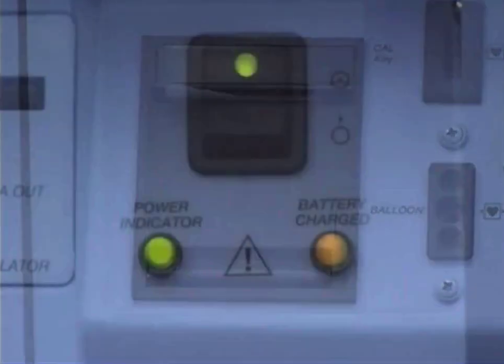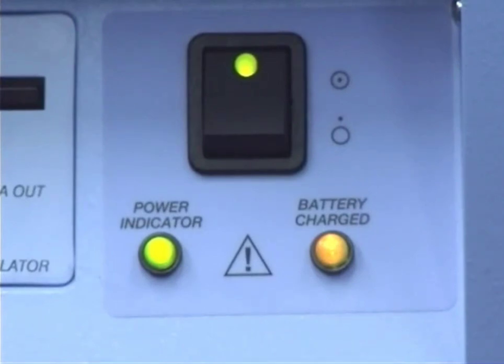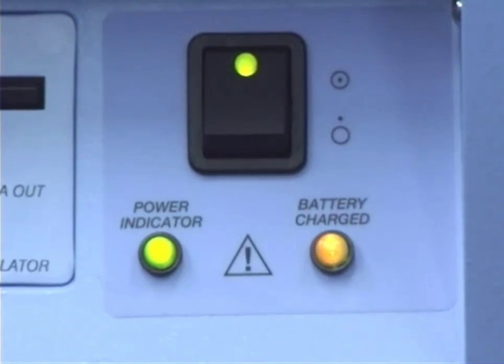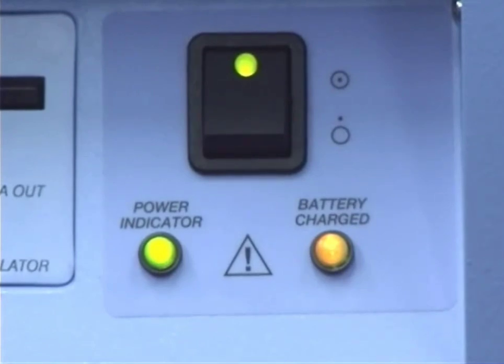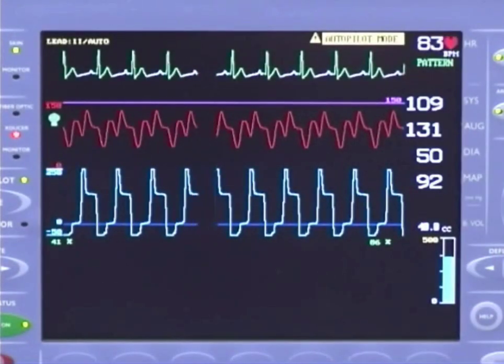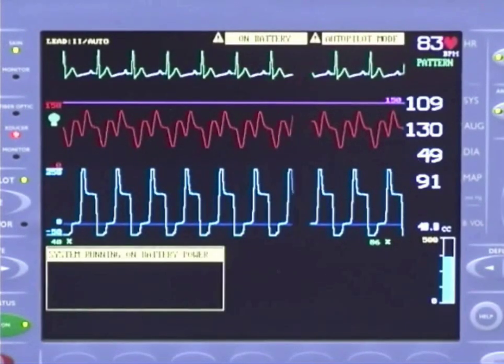There is also a strip chart recorder. The power on/off switch is located on the front panel and is illuminated when on. There are two indicator lights on the front panel. The green light indicates that the console is receiving AC power. The amber light indicates that the battery has at least an 80% charge. The battery, when fully charged, has 90 minutes of operation. When the pump is running on battery, an on-battery message is displayed on the monitor screen.